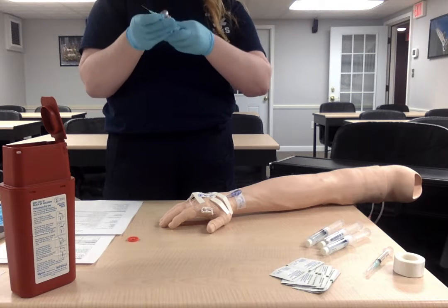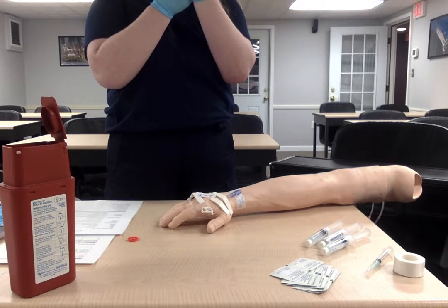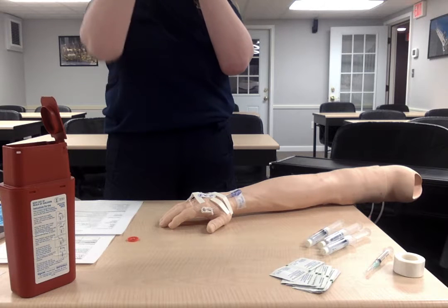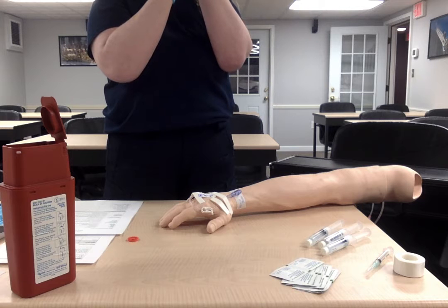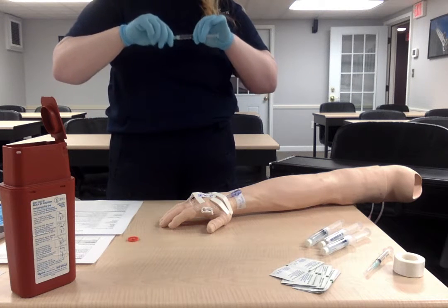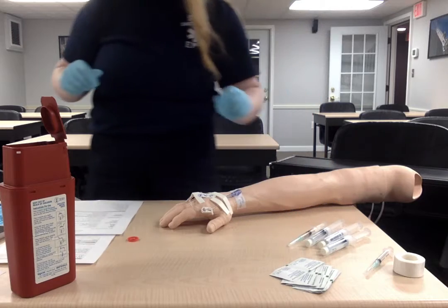And we are going to draw up the 2 mLs. We're going to make sure when we're drawing up that there are no air bubbles or anything like that, because we want to make sure that we don't risk anyone for air emboli. Okay, so we have the 2 mLs. We're going to put that over there and recap this so that the needle stays sterile. You can put that down at this point.